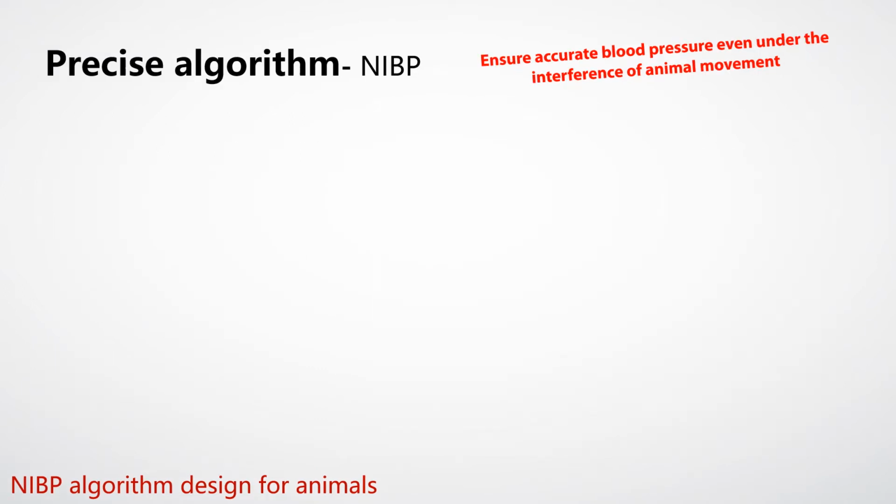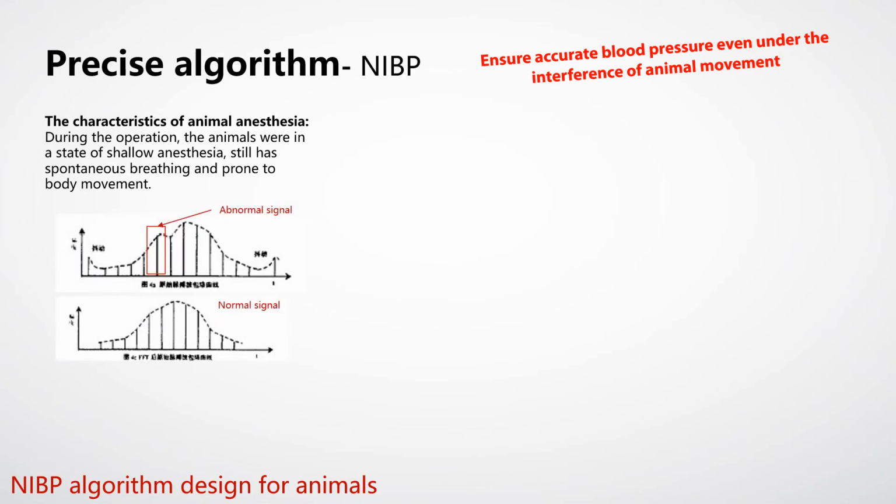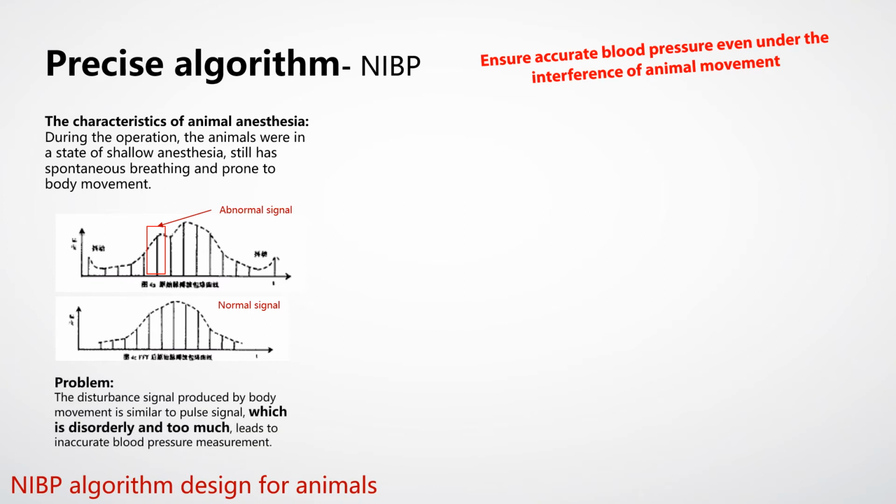And the second factor that affects the NIBP measurement is the motion of the animals. During the operation, the animals are in a state of shallow anesthesia, still have spontaneous breathing, and are prone to body movements. By the body movement, there will be interference on the NIBP measurement result, as we can see from the picture, the noisy signal. The disturbance signal produced by the body movement is similar to the pulse signal, and it is disorderly, and too much interference leads to inaccurate blood pressure measurements.